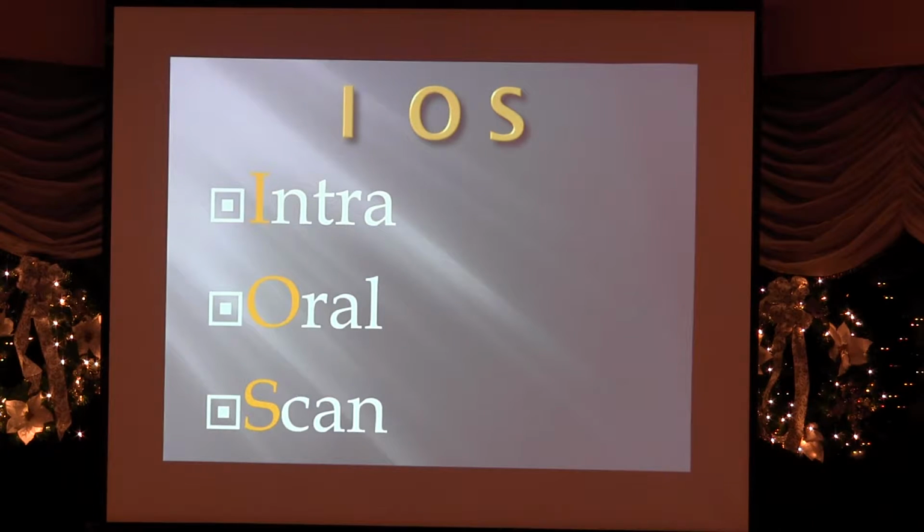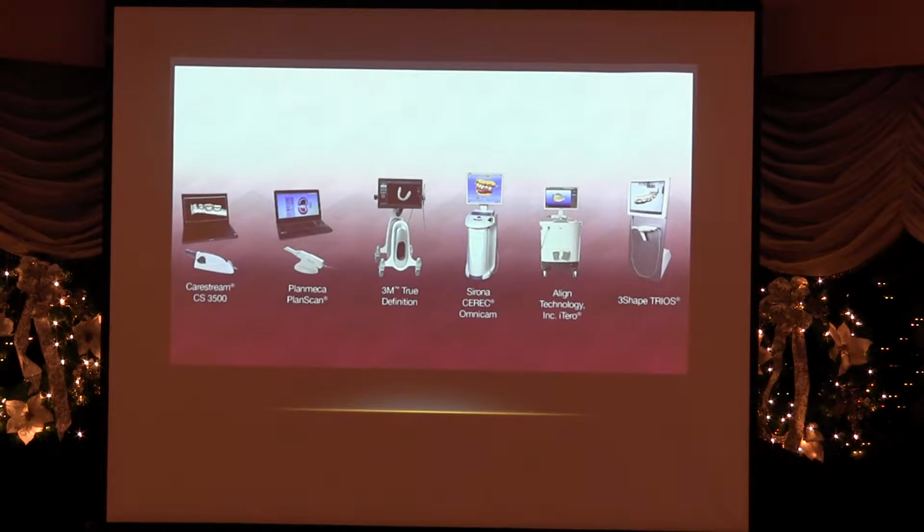So, intraoral scans. These are all intraoral scans that we can receive files from and work with. Some of them we have direct access to, such as 3Shape Trios, iTero, and Cerec. That means you don't need to pull an STL file. There's a direct link from them to our portal, so as soon as you take the impression and click our lab name, it will send the whole impression. You don't need to do anything else.